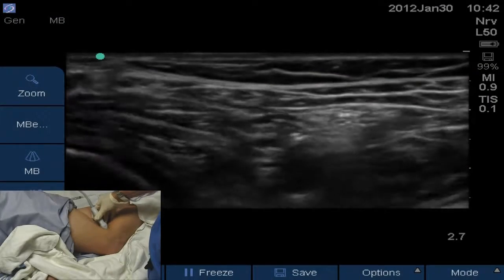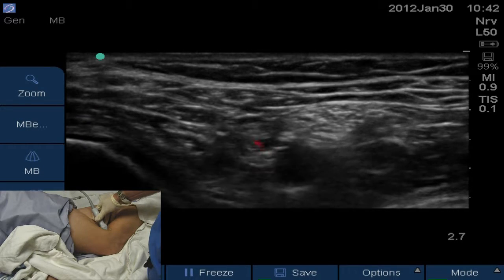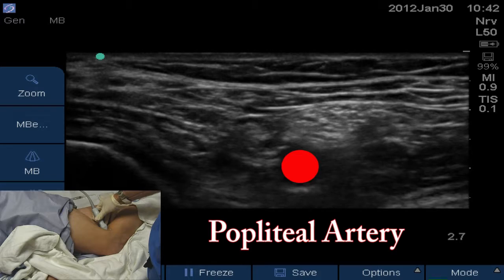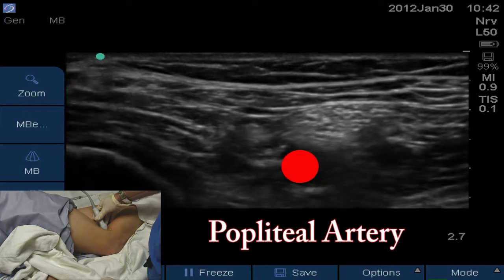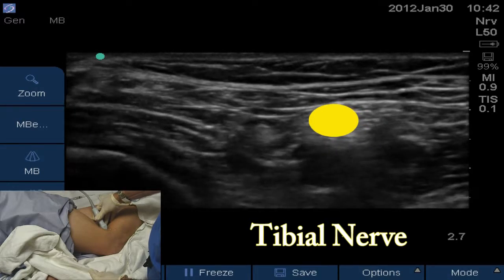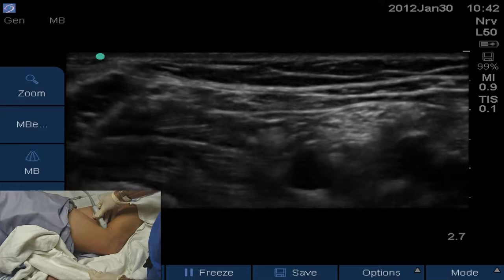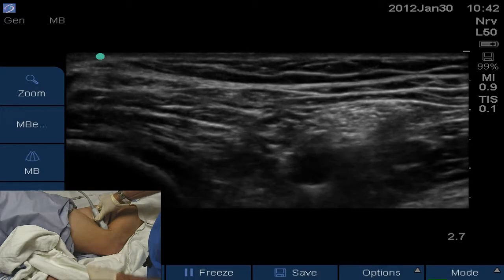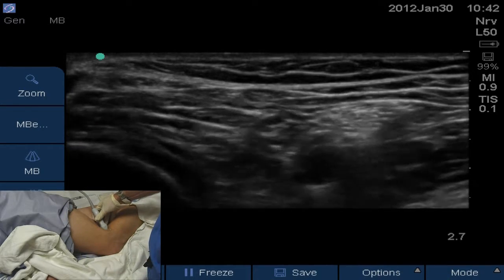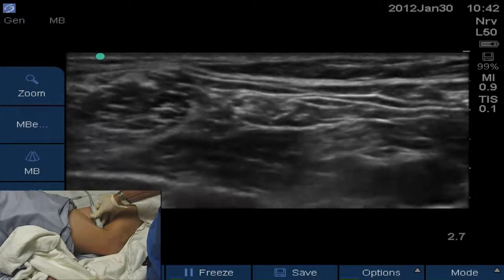And the first thing we're looking for, as usual, is the popliteal artery. I can compress the vein and still see a pulsatile popliteal artery there. Relative to the artery, if the artery is a clock face, the tibial nerve is located at about 12 or 1 o'clock position, a bright white hyperechoic honeycomb shape there. Relax the pressure, the vein blows up a little bit, hold the pressure down, the vein is collapsed, but the artery remains pulsatile.